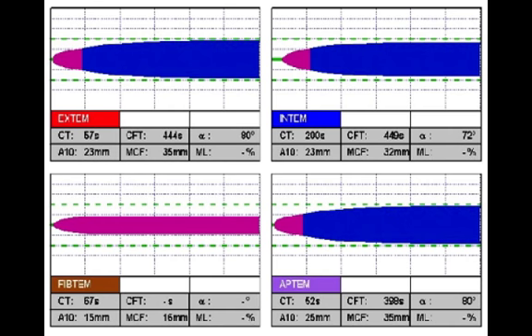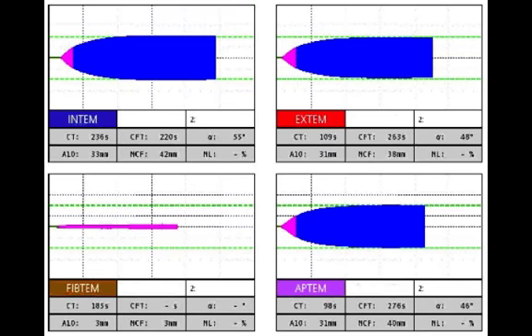We then take a look down at the fib-tim, and you can see that this fib-tim, even though it also has a blunted alpha angle at the start, does show a very nice thick clot formation here. So the next one is almost kind of the exact opposite.